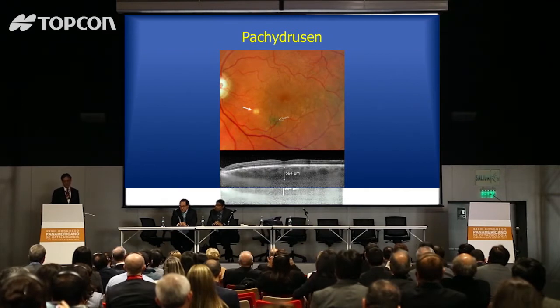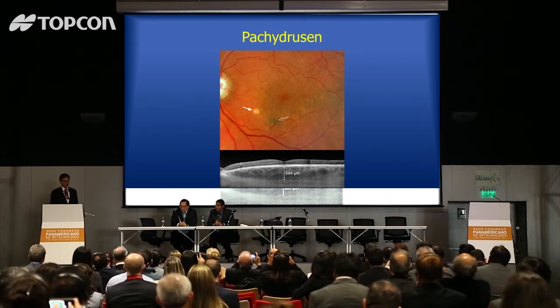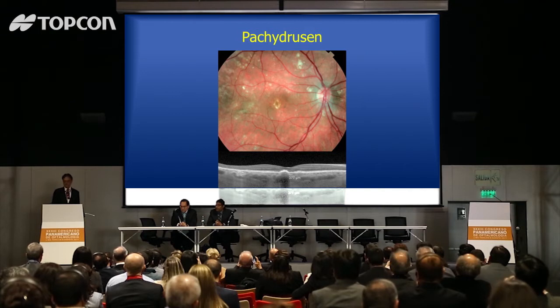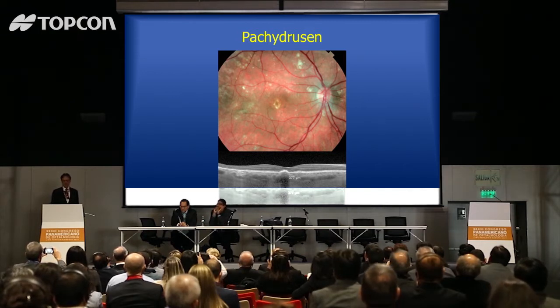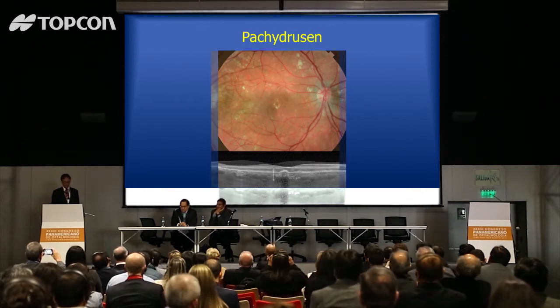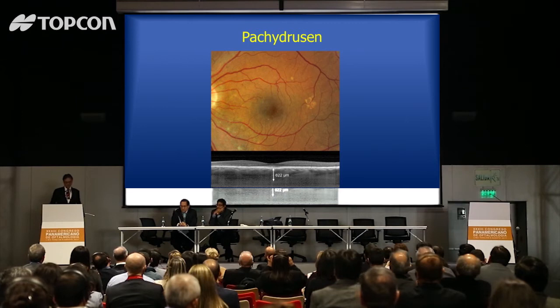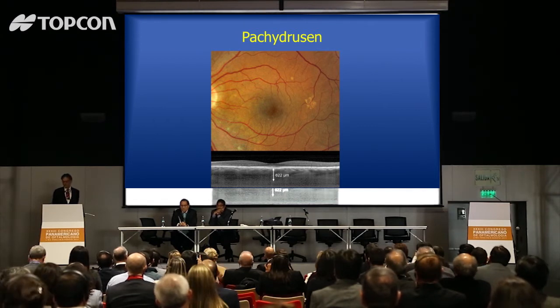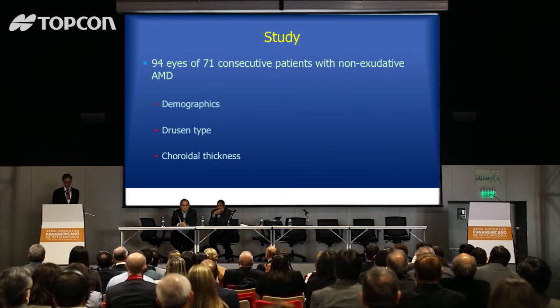Here's an example of one druse by itself. Ordinarily with soft drusen there'd be many others nearby, but pachydrusen are often found alone. They have bizarre shapes, found scattered throughout the fundus, not just in the center. Here's another patient with pachydrusen — notice the strange complex shapes, not round or ovoid, with complex outer borders, and a thick choroid underlying them.